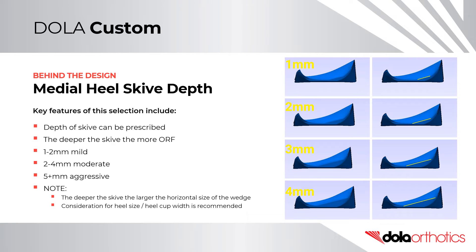The depth of the skive is prescribed by the practitioner. The deeper the skive, the more orthotic reaction force created. A one to two millimetre skive will be mild orthotic reaction force, two to four millimetres moderate, and greater than five millimetres aggressive. Note: the deeper the skive, the larger the horizontal size of the wedge. Consideration for heel size and heel cup width is recommended.